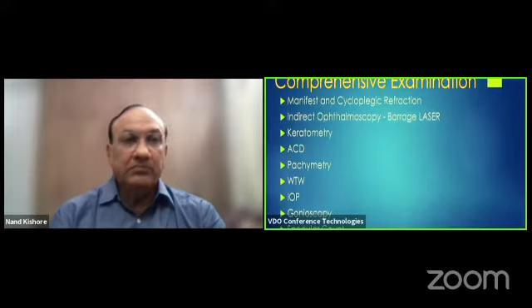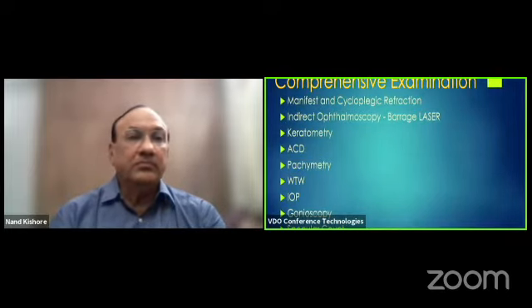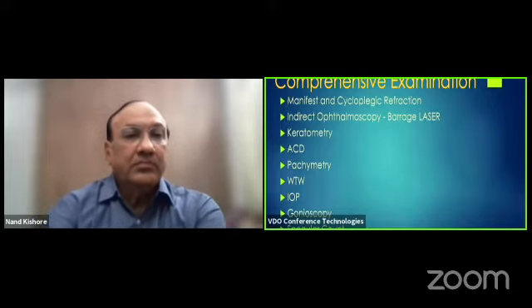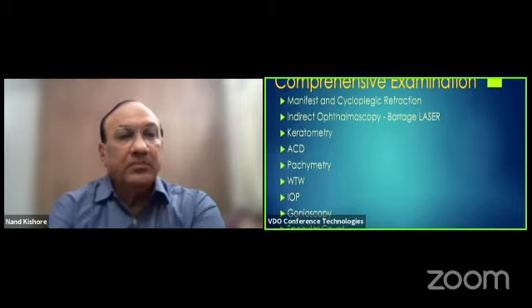A thorough, comprehensive examination needs to be done in all these cases for evaluation. A proper refraction is mandatory. We need to take care of the retina as well. Otherwise, they will blame the surgeon once anything happens.